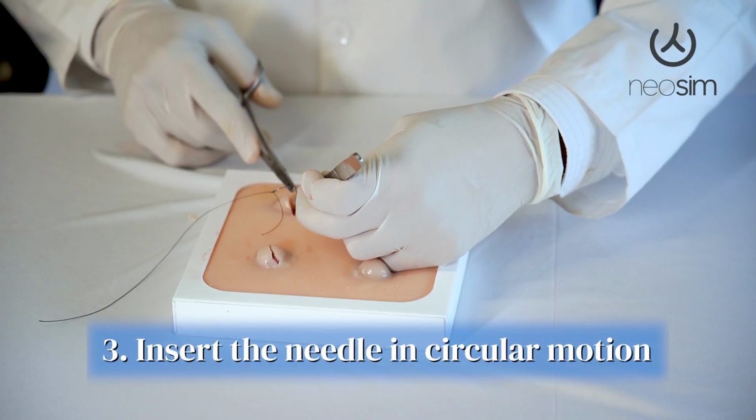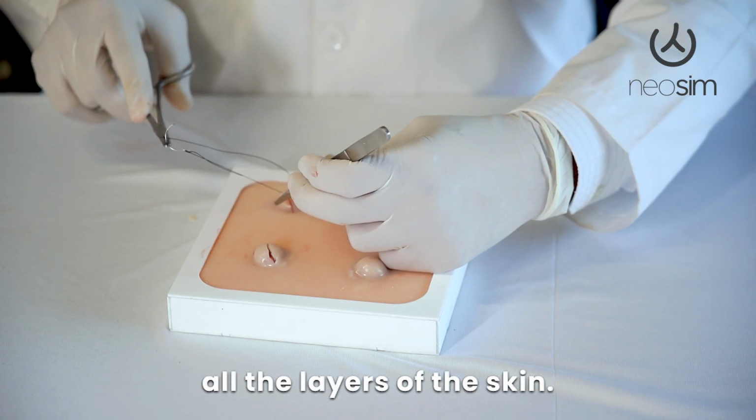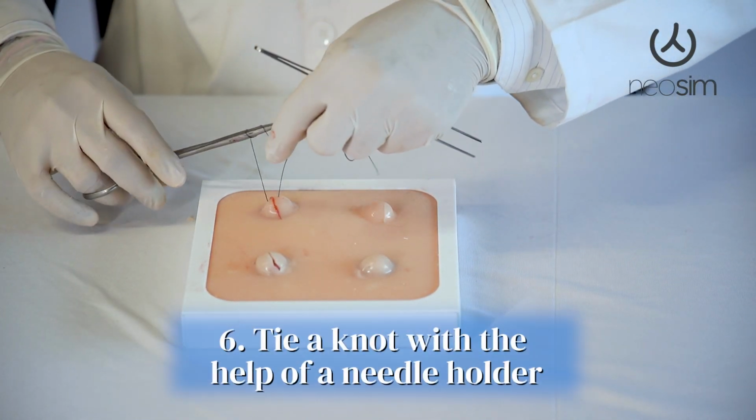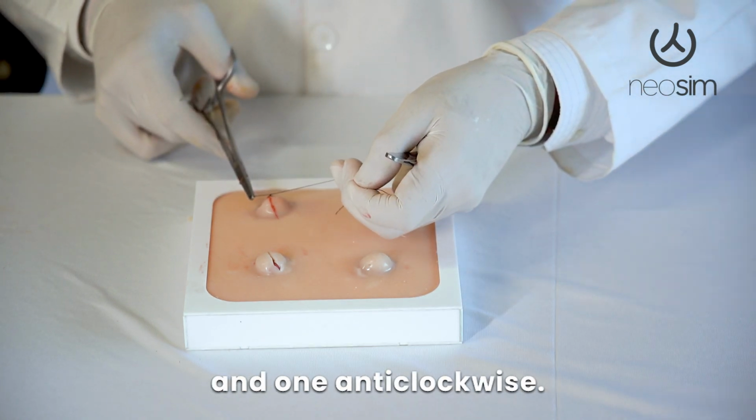Now we will put the sutures and use the needle in a circular motion. Remember to catch all the layers of the skin. Now you put a knot, put the needle holder on the knot, and you make one clockwise and one anti-clockwise. Use the scissor.